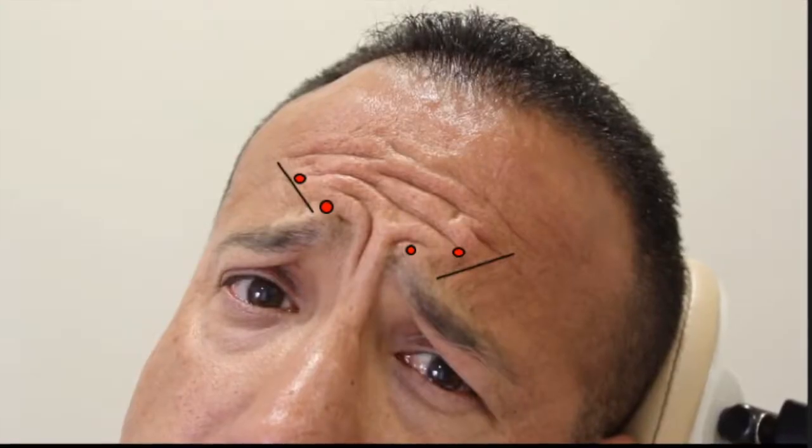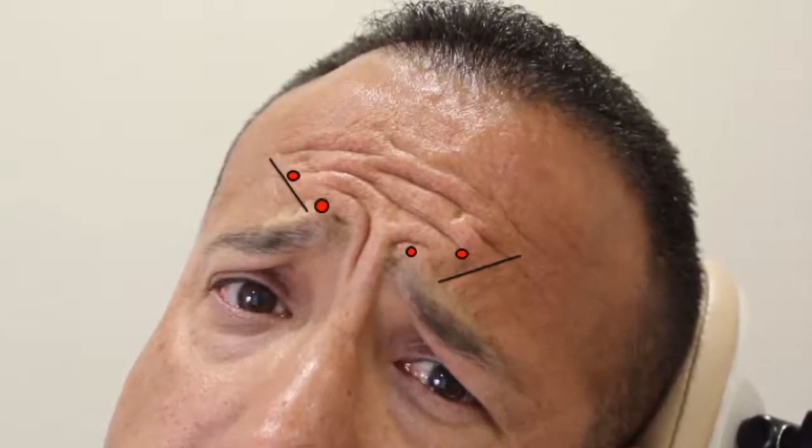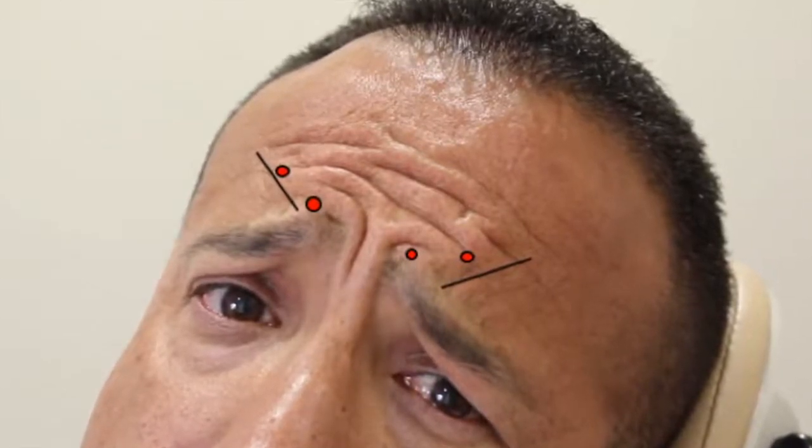Here, the diagonal lines mark the lateral ends of the corrugator, and the red dots show the points of administration of the toxin. Notice the little dimples that mark the lateral end of the corrugators. And let's not forget to show the little triangular procerus muscle, which is also an important part of the frowning mechanism.